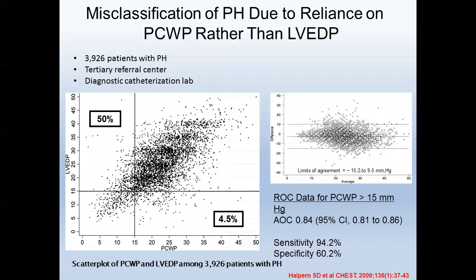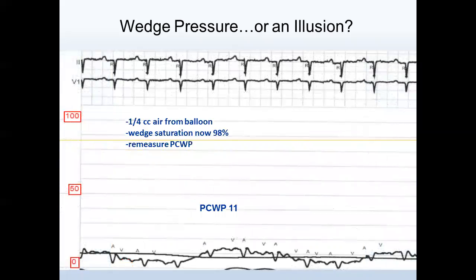Why is this important? Yes, sir. How far do you pull back towards the main PA before you pull the balloon down? Because if you just drop it to a quarter, it could shoot out quite a bit further.